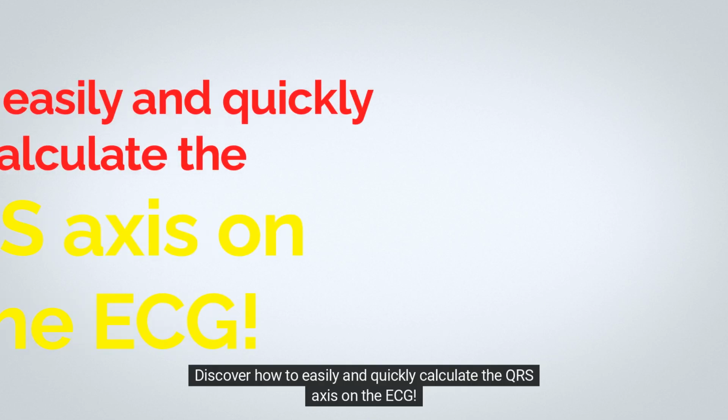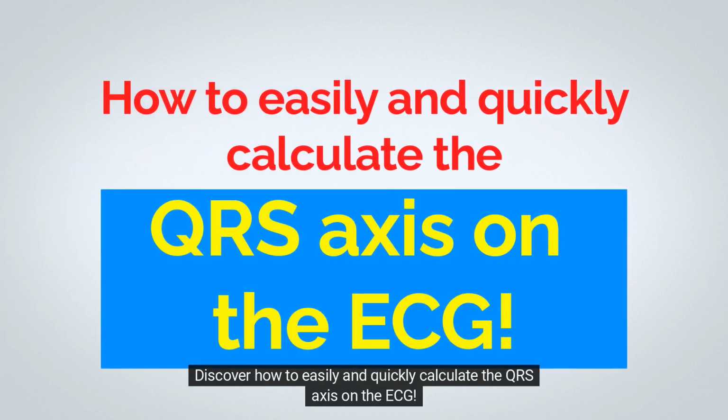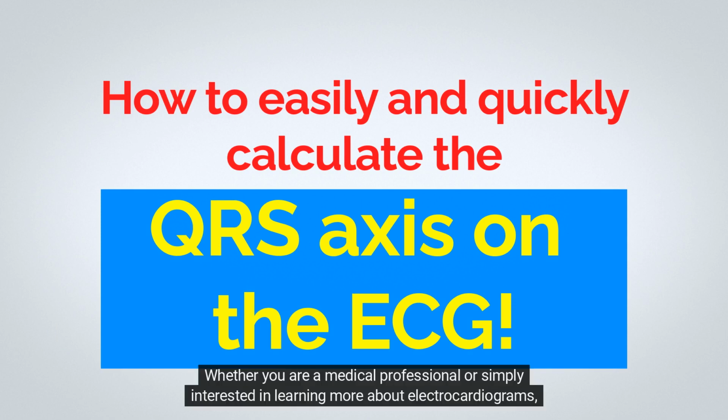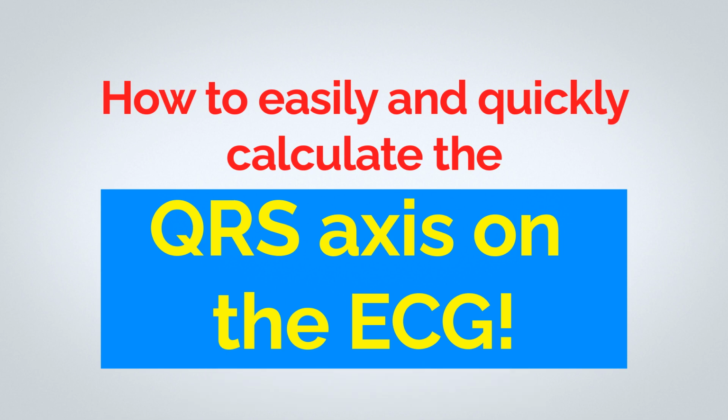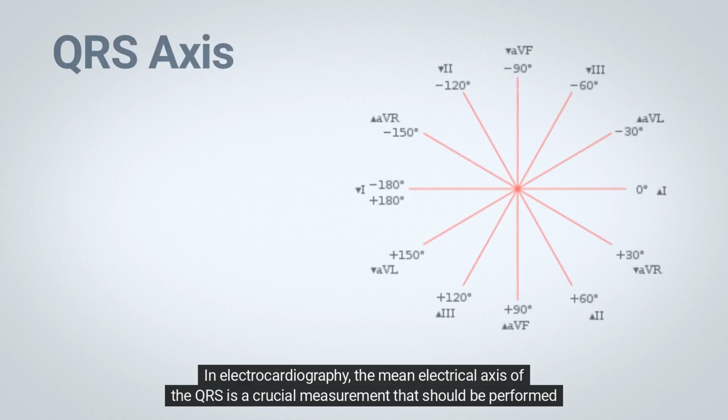Discover how to easily and quickly calculate the QRS axis on the ECG. Whether you are a medical professional or simply interested in learning more about electrocardiograms, you won't want to miss today's discussion. Let's get started.